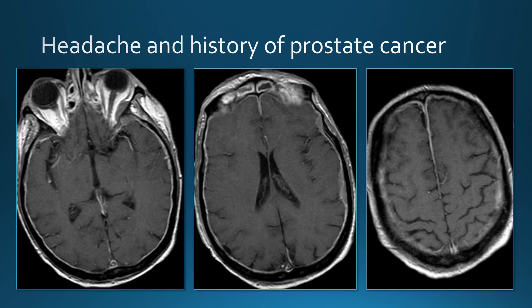Some other patients with pachymeningeal enhancement: this patient has a history of prostate cancer, and we again see diffuse pachymeningeal enhancement, but in this case there are some areas where it's more focal and thicker. If you see pachymeningeal enhancement that is somewhat non-uniform with thicker areas, we're more often dealing with neoplastic pachymeningeal involvement — this is a patient with metastatic prostate cancer.